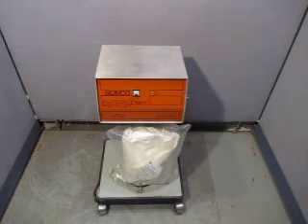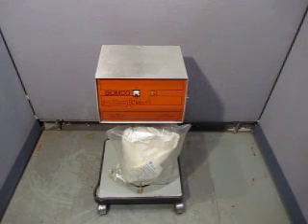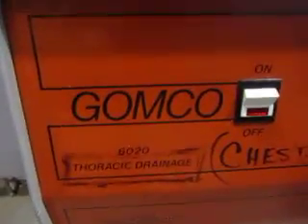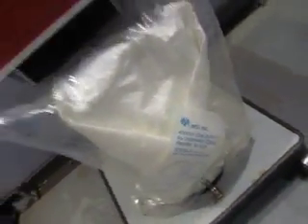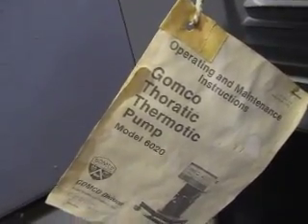Up for auction we have a Gomco Thoratik chest thingy. We'll figure out what it is in a second here. I know it stands 33 inches. So let's figure out what this sucker is here. Take you on a little virtual tour. So it says Gomco Thoratik Drainage 6020, one bottle set. It's a thoratic pump. There we go — it's a Gomco Thoratik thermotic pump, Model 6020.